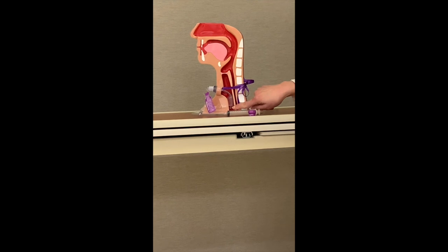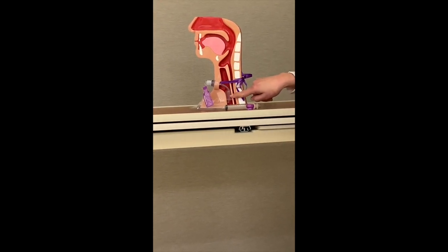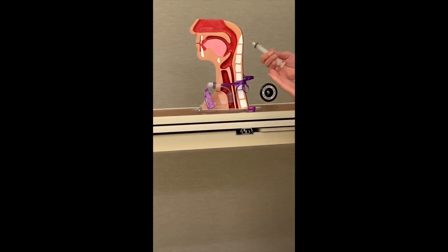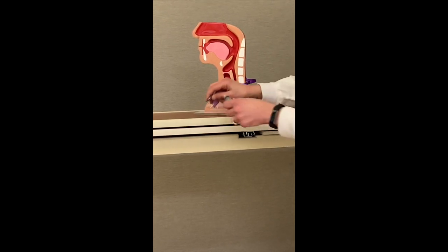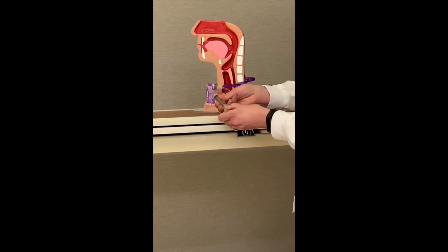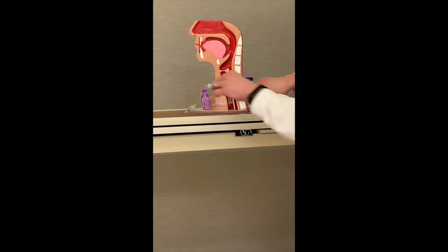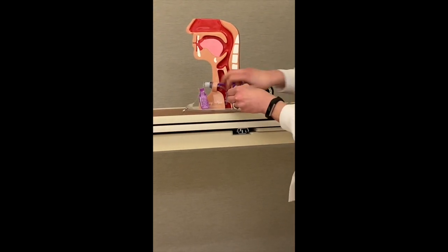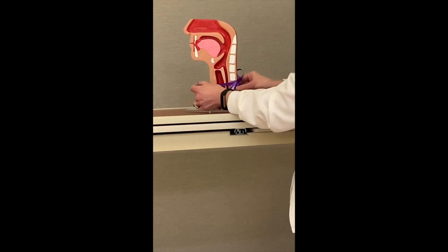You can see here that the cuff is doing its job and sealing the airway around the tube. So if the patient were on a ventilator, for example, we could achieve a good seal and maintain our pressures. Since that's not the case, we can use a 10 cc syringe to withdraw the air from the cuff. And now you see we have plenty of room for air to move around the tube. And the speaking valve simply pushes straight on.